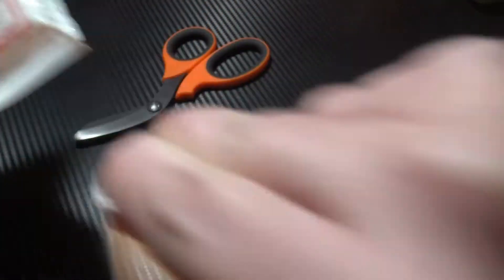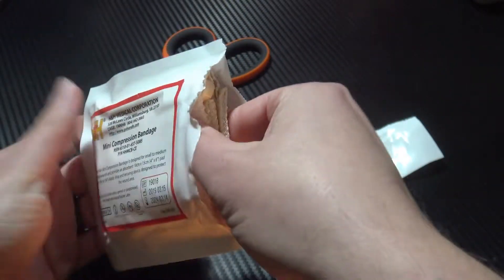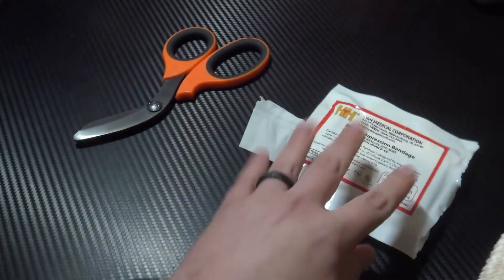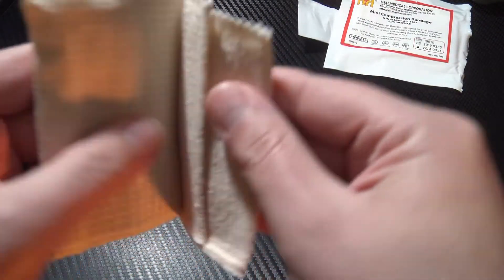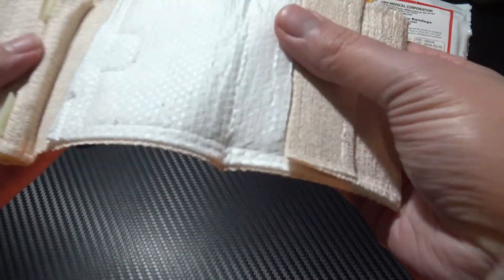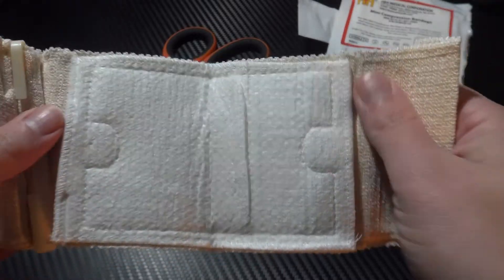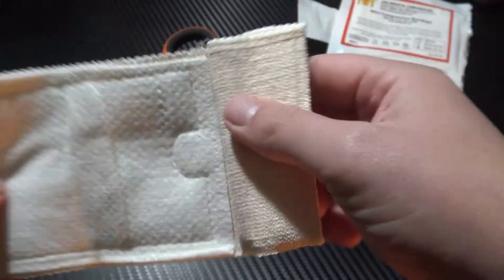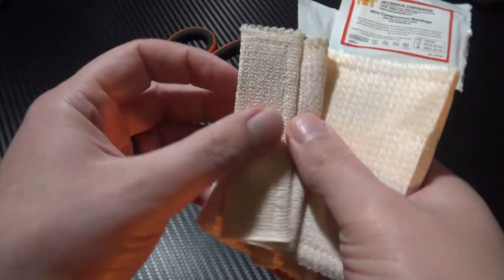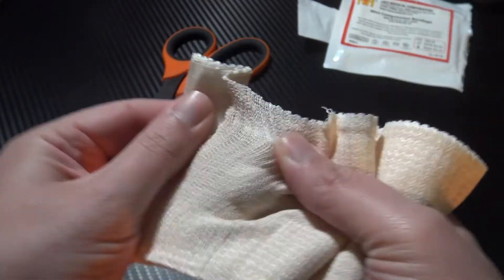Open it up and you immediately have access to the dressing itself. Pull it out, toss the packaging to one side, and then you have your actual bandage material. Opening it up, first things first, you have your large wound pad — this is four inches by six inches — which is going to do a decent job of covering the wound site.